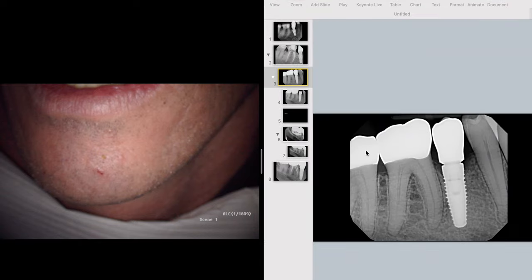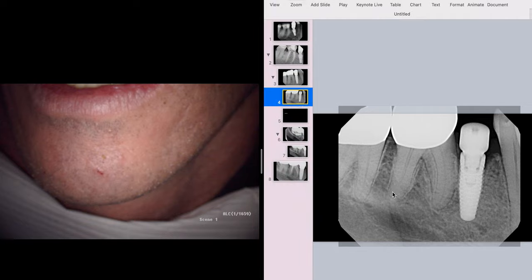Let's take a look at this radiograph of tooth number 4-6, or 30. We've got a zirconia crown on here. We don't have any PDL widening, and you wouldn't expect that — we diagnosed this case as tooth 4-6 with symptomatic irreversible pulpitis with symptomatic apical periodontitis. We've got a calcified pulp chamber but fairly open canals. We did a shift shot to help us, and when I see this calcification I'm always thinking two canals in the distal — one of the most missed canals is the distal canal.